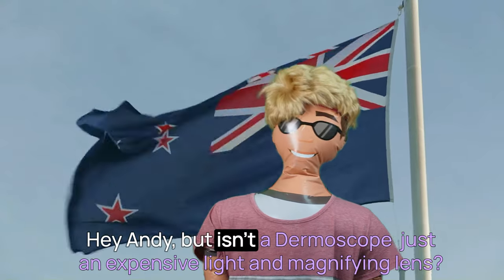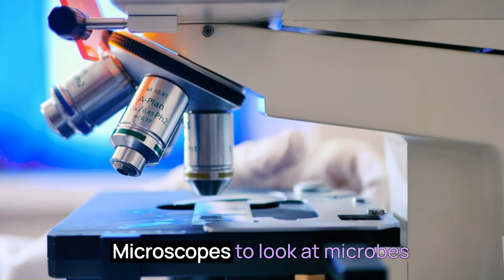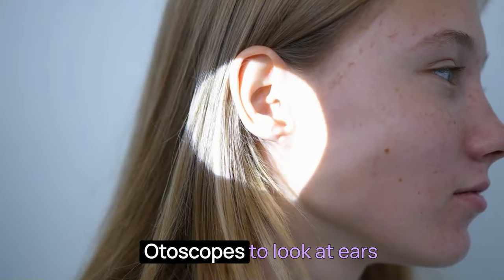Hey Andy, but isn't a dermoscope just an expensive light and magnifying lens? I mean, we have microscopes to look at microbes and otoscopes to look at ears.